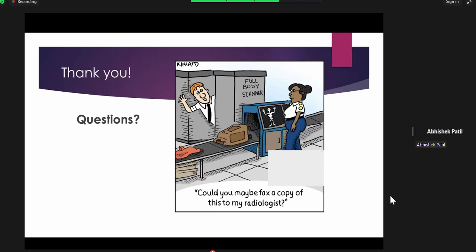Yeah, I'm sure. Okay. And the other question is, which other conditions are there where we can have reflux in the IVC? I'm sorry, could you repeat that question? Which other conditions can show reflux in the IVC?